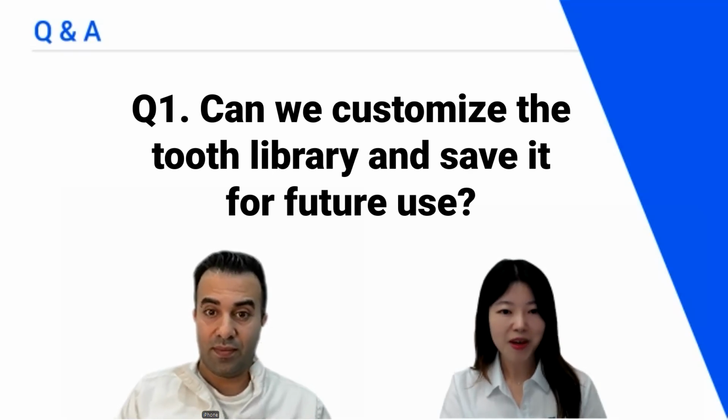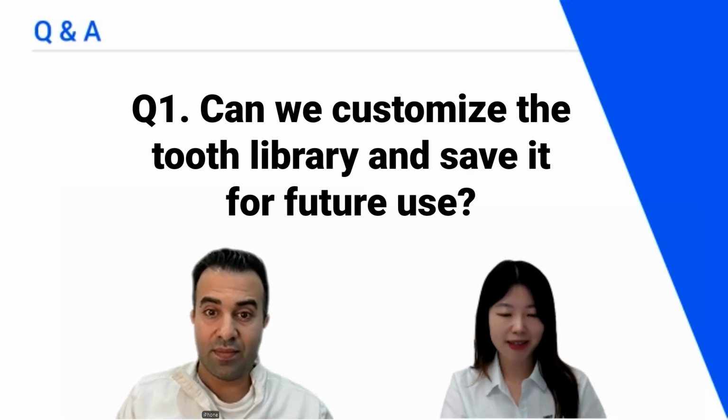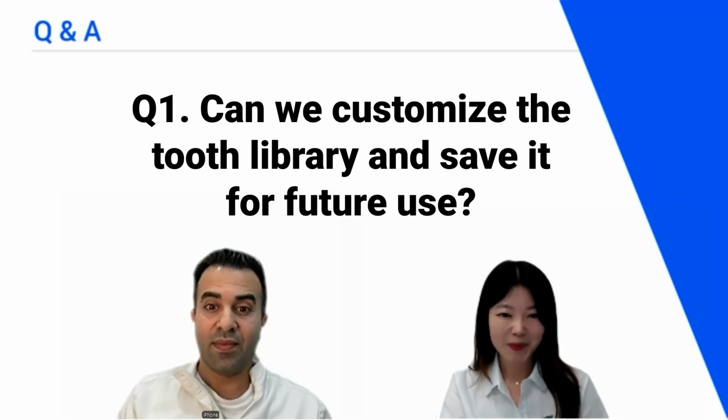Oh, I think everyone must be so curious about the customized tooth library. So maybe it would be great if you can cover it next time. 100%. Yeah. Okay. Next question.